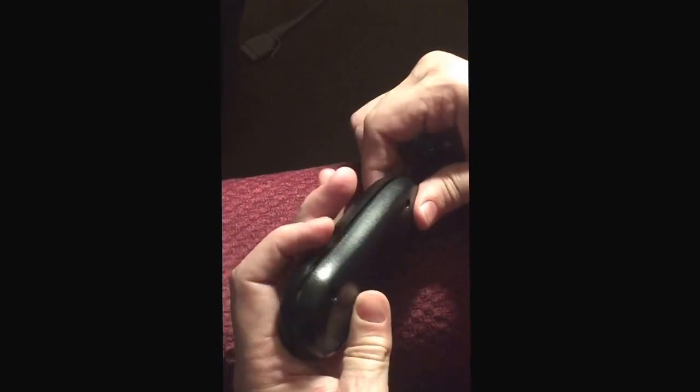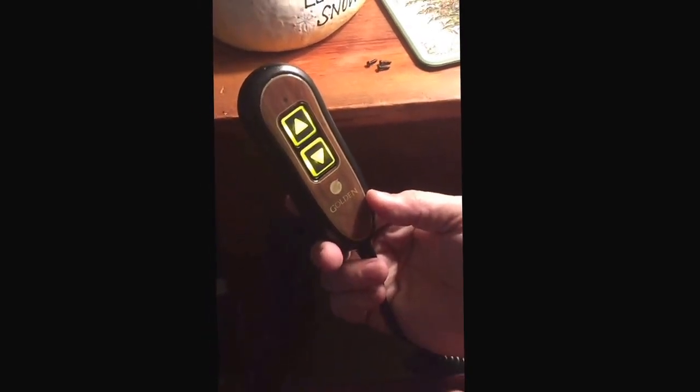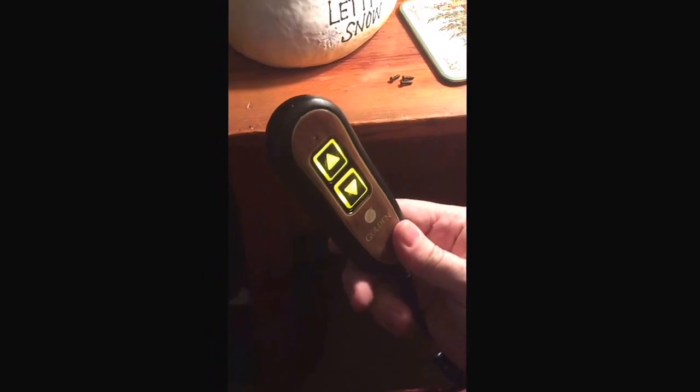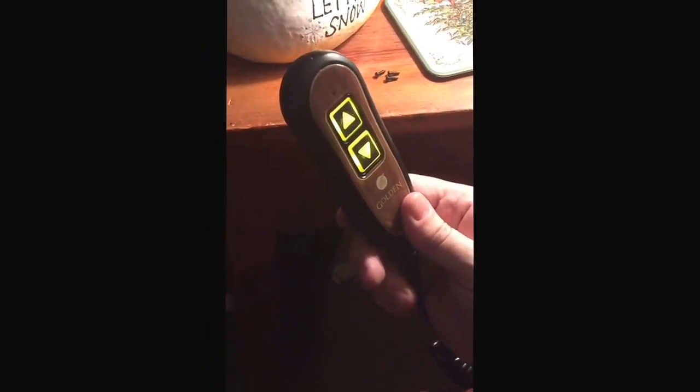And voila. So if you're having problems with your Golden remote and the lights keep going on and off, it's probably a problem with that connection down in the bottom. Just take it apart, push them together, and somehow, like I did with the bread ties, try and secure them so they don't come apart again.